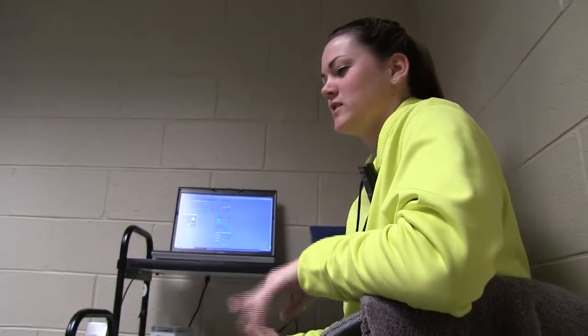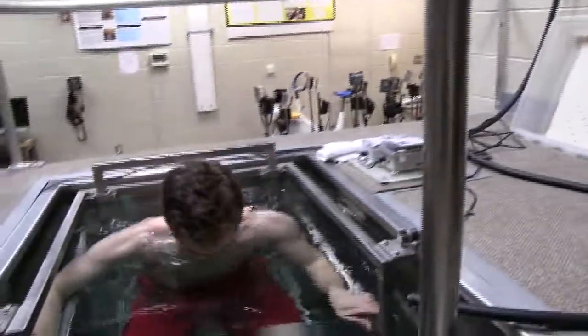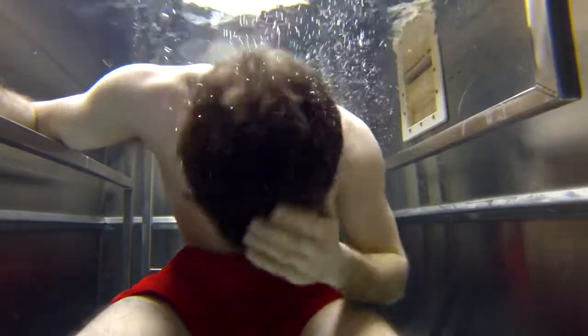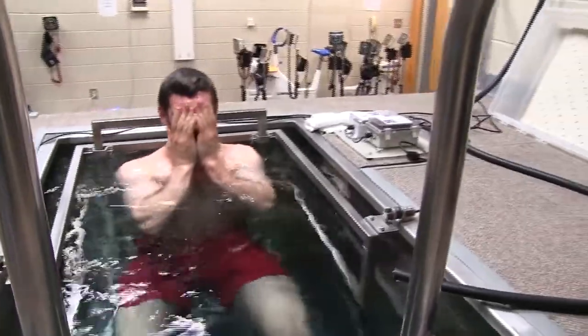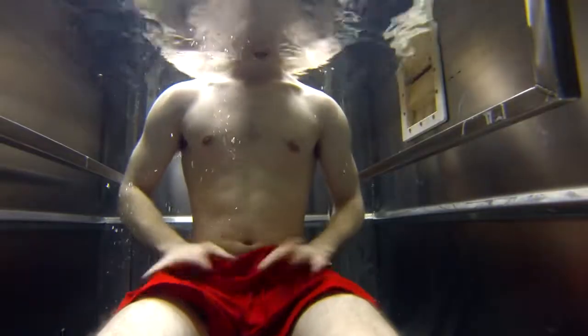Before the test, the subject needs to dip their head under water and make sure all their hair gets wet, because we want to get all the air bubbles out. Then pat out your shorts and rub down your legs to make sure there aren't any more bubbles.